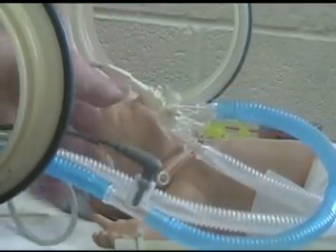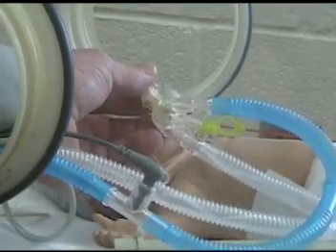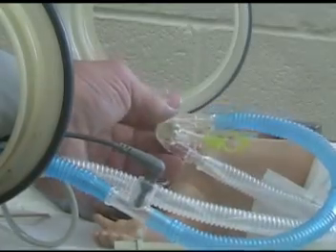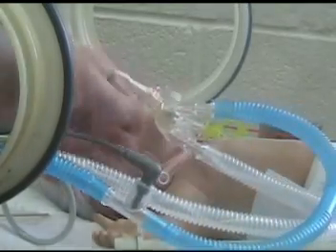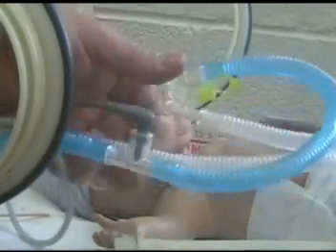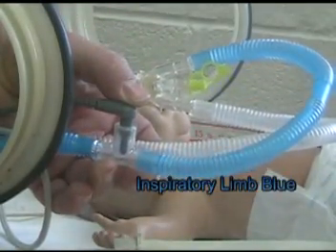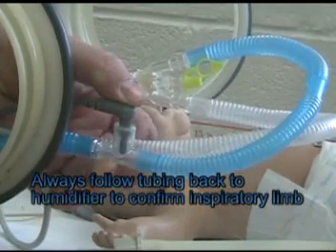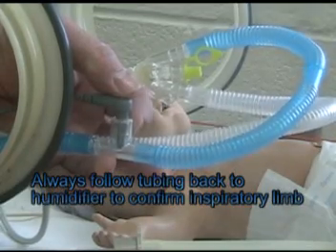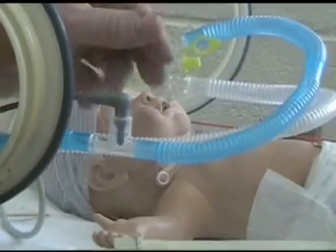Up here is a sensor that measures inspiratory and expiratory flow and translates that into volume. Blue indicates inspiration — we know that because the temperature probe is always on the inspiratory side. If it's on the expiratory side, the machine will not be able to maintain the heat and may overheat or underheat the infant.